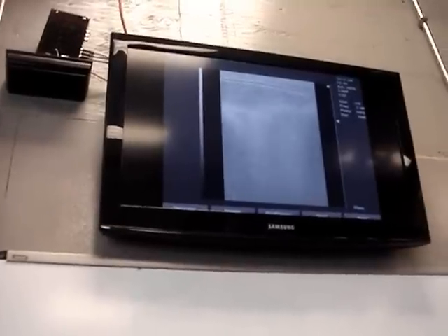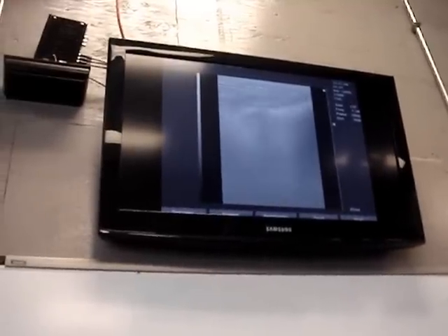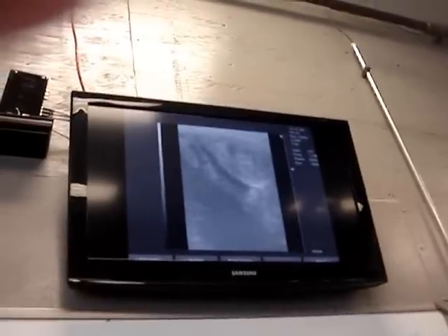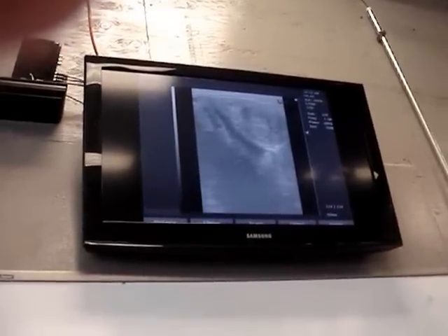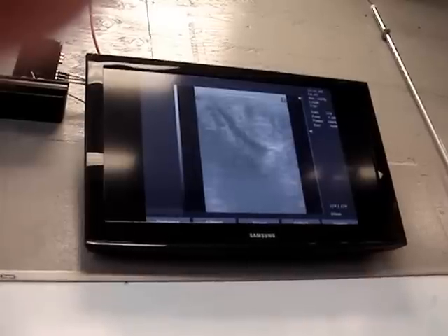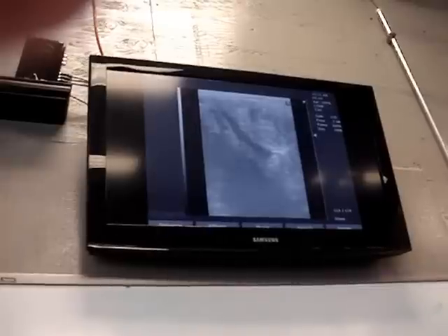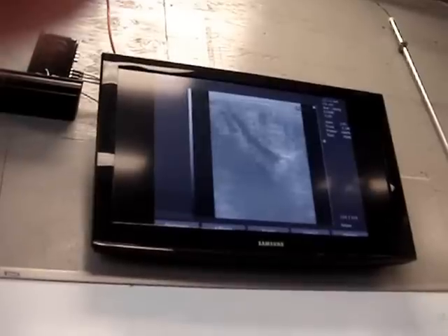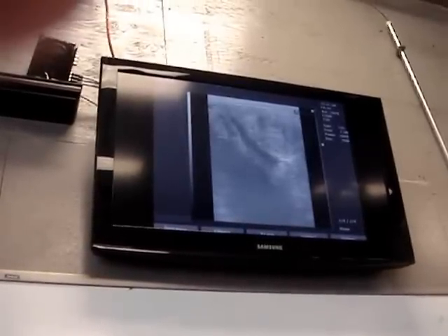And I'm just moving up here. Just pull in. There we go. Alright, so you have to kind of use your imaginoscope a little bit, but when you see enough of these, you start to pick it out. But this round structure here, this is actually a cross-section of her uterine horn. So it's a tubular structure, and my ultrasound probe is looking down on it in a transverse manner, so it makes it look round like that. And that's actually her left uterine horn.